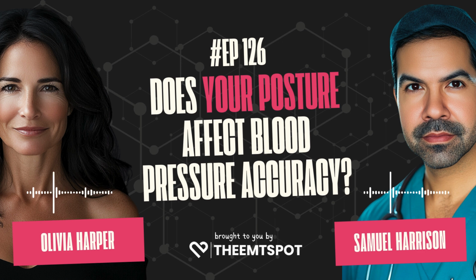What about other situations? Like, let's say I'm at a health fair and they're using one of those automatic cuffs at a kiosk. Those can be a little tricky. You want to make sure the cuff is the right size for your arm and that it's positioned correctly. If you're not sure, just ask the person doing the test. Yeah, good point. It's easy to just assume they know what they're doing, but better safe than sorry.